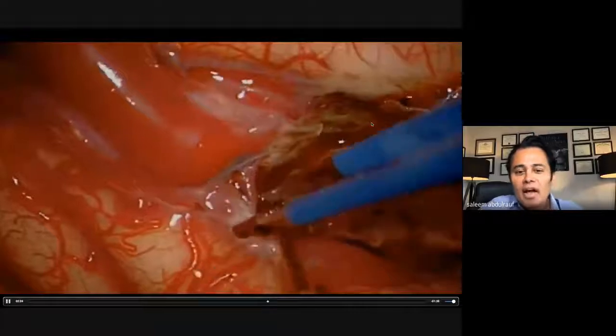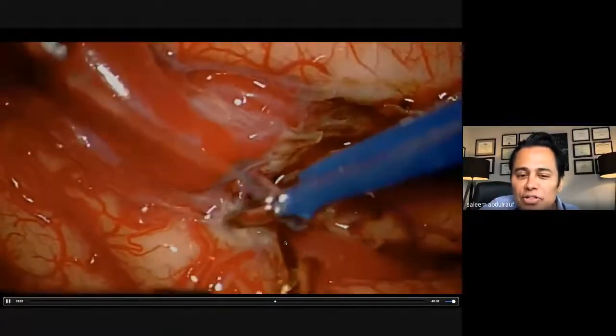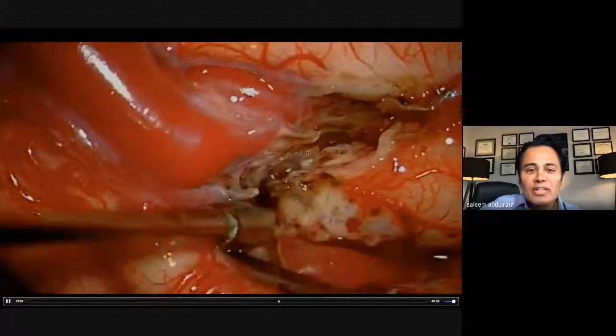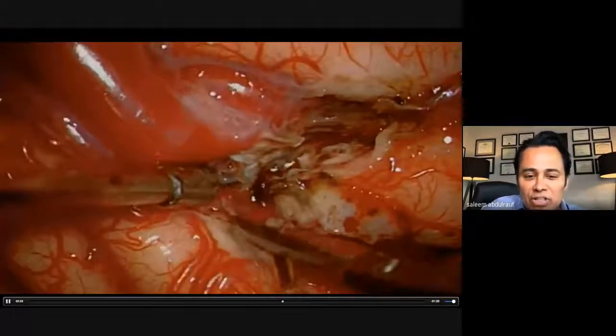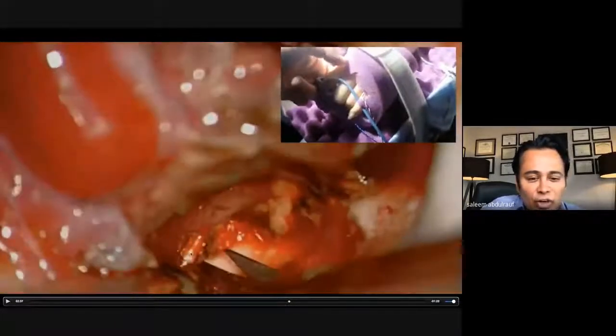Okay, I'm happy, I coagulated now. If I was under general anesthesia, I would be very nervous. I would not know. I would be guessing. Okay, so I'm now deep inside the central sulcus. Okay, inside. This is a critical issue.